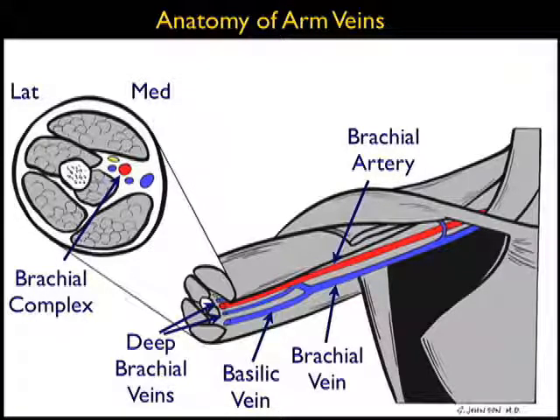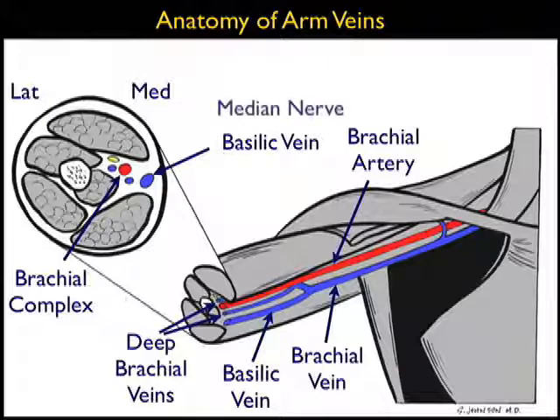Looking at the short axis view, we can see the brachial complex — the brachial artery surrounded by two deep brachial veins — and the more superficial and medial basilic vein, which is really the preferred target for a deep ultrasound-guided IV. Note the median nerve lying on top of the deep brachial vein, which must be avoided during a puncture attempt on this structure.